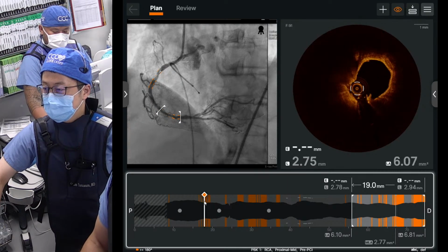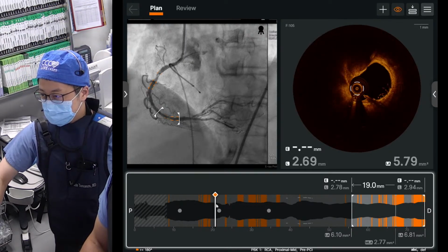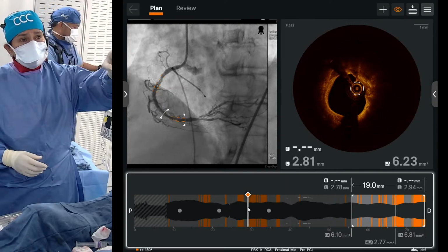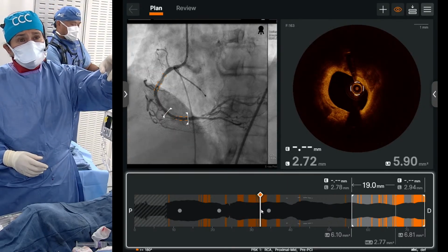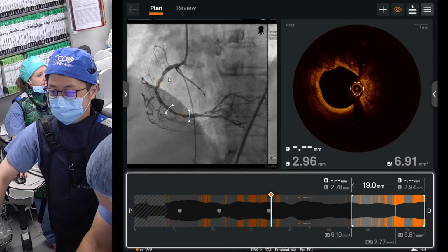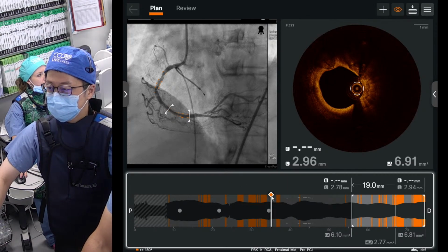Now, the question is what the audience wants to learn. I know we have shaved the tightest part. Go further down, right there. Did the rotor do anything? Not like it. This part is an open artery between the first nodule lesion, but we might have a second nodule lesion more distally. Okay, go more distal.